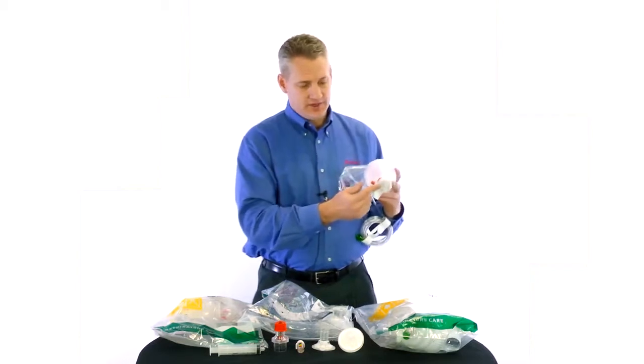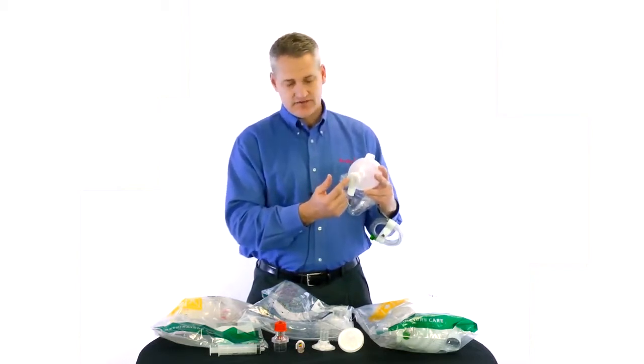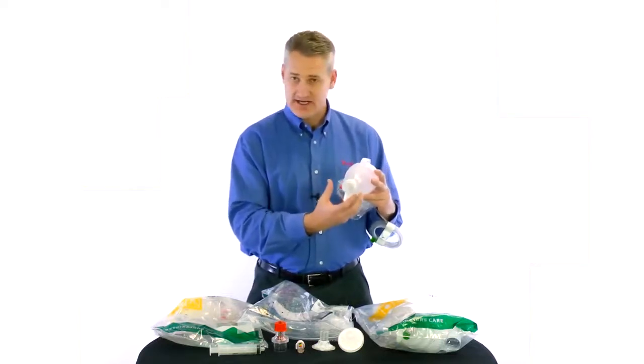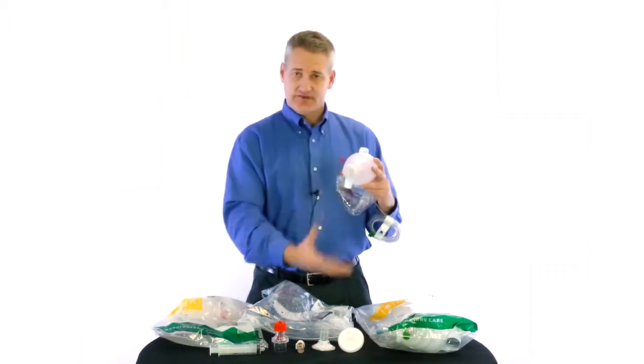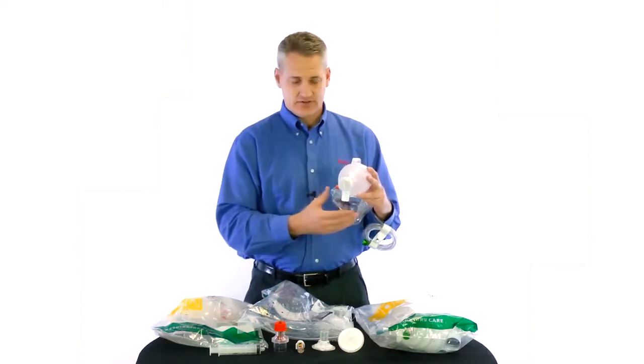Moving forward, we also have our deflector cap, which is a standard feature on all of our bags. This deflector cap is here to catch material that the patient may be regurgitating or spitting up through the Ambu bag. It will catch it, deflect it away from the clinician or caregiver, as a safeguard to protect you from contamination.